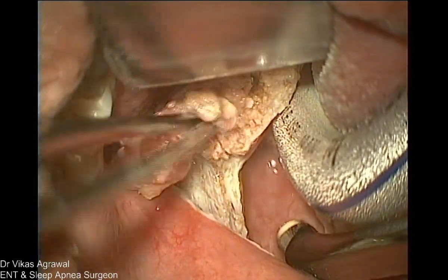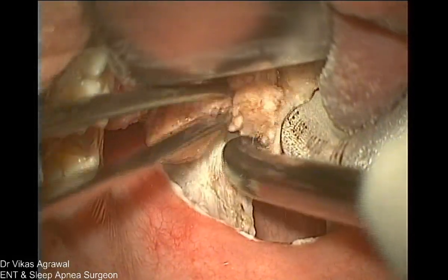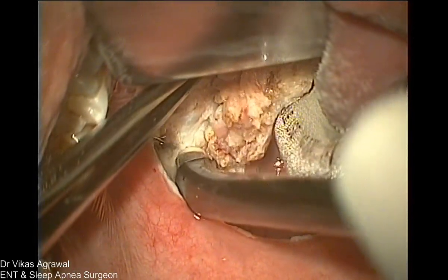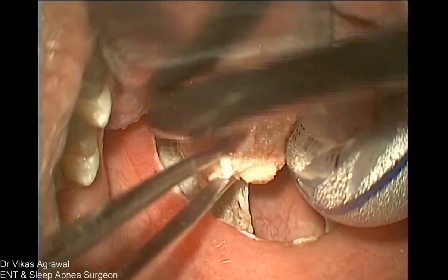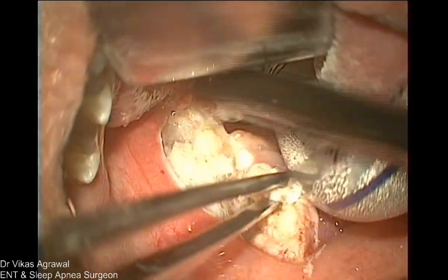Okay. Right. So the vertical fibers we are preserving, the oblique fibers we have removed. There is still a little bit of tonsil dissection left, so I'll complete that. See, the space is so little, the tube is there, the uvula is there, the tonsil is there.